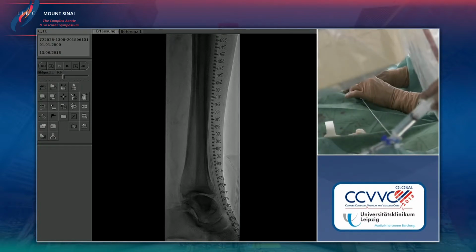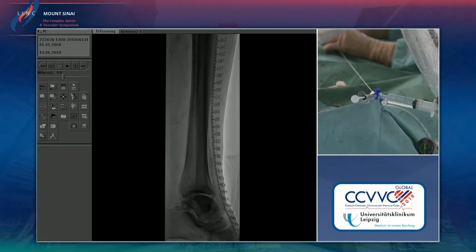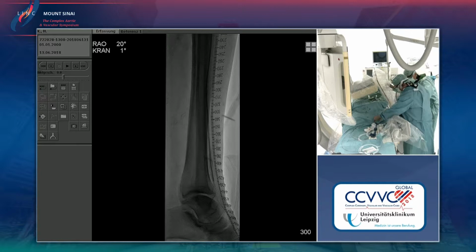And I actually cannot remember a case where we really thought that a residual stenosis or recoil was due to some compression from outside from that medication. No, not really. Okay, I think I start here now, and we magnify now.